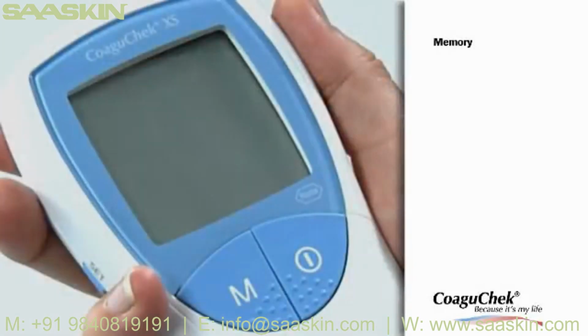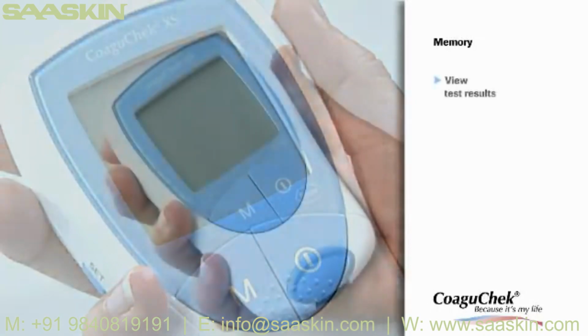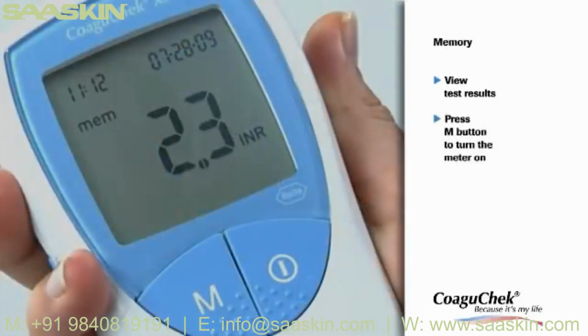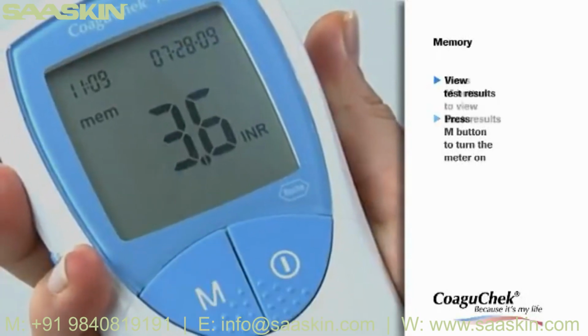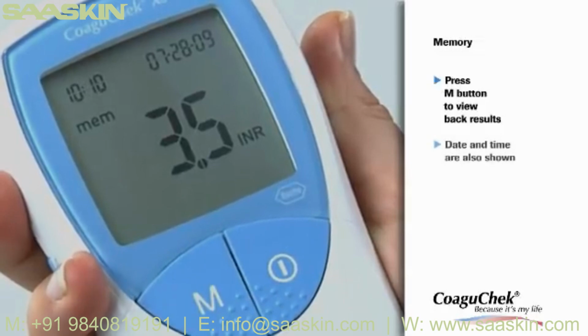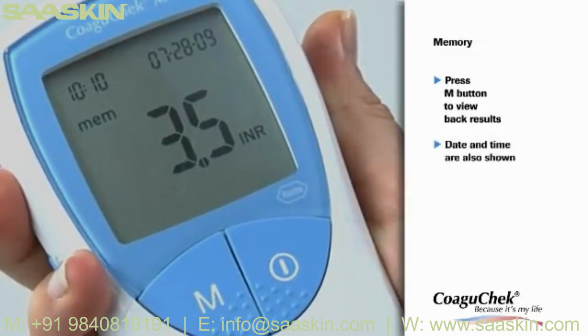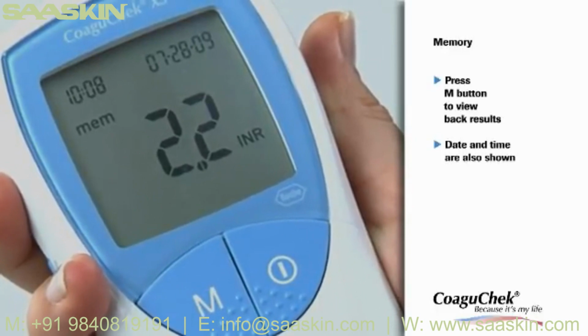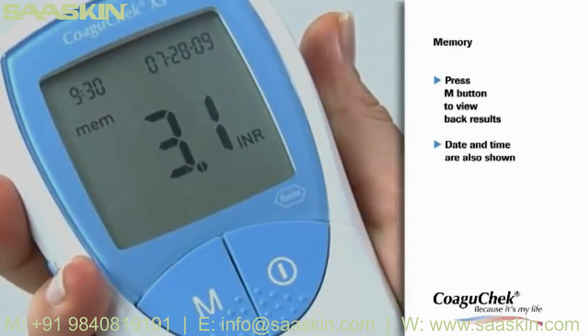The CoaguChek XS meter has a 100 value memory for saving results along with their time and date. If you wish to view the last results, then please press the M button to turn the meter on. To view back results, press the M button. Date and time are also shown, so that it is easy for you to enter the test results in your coagulation diary and for your doctor to interpret the values, so you can be confident that your therapy can be optimally geared towards your needs.